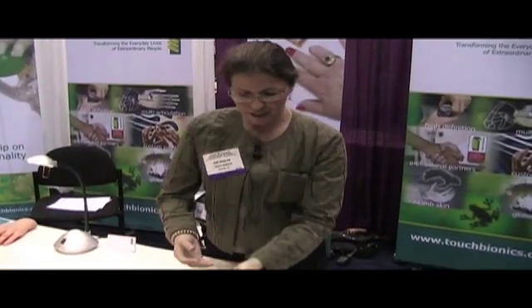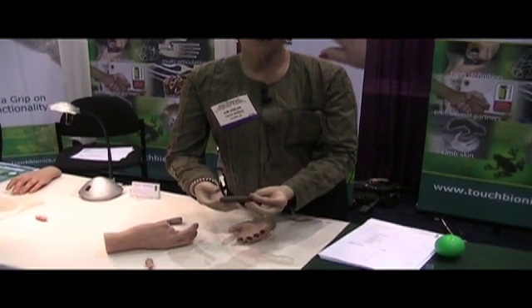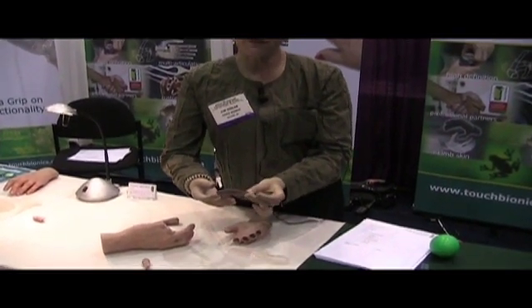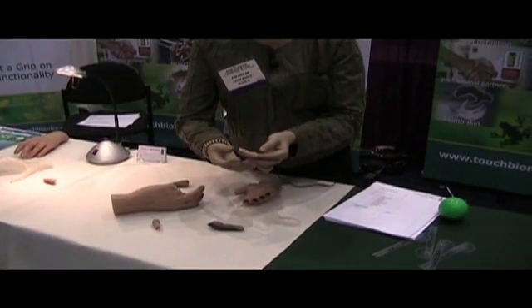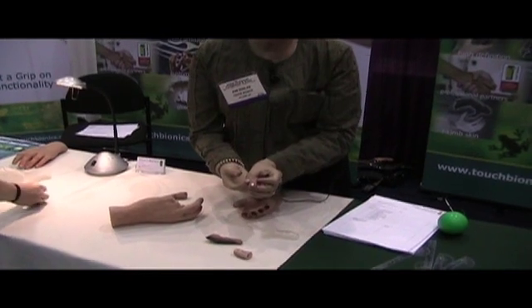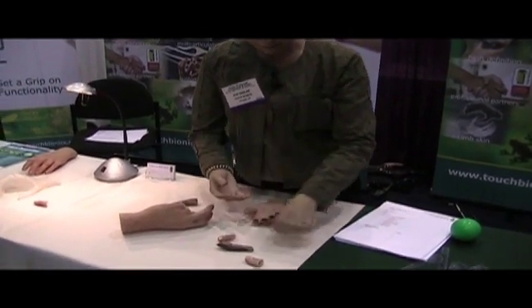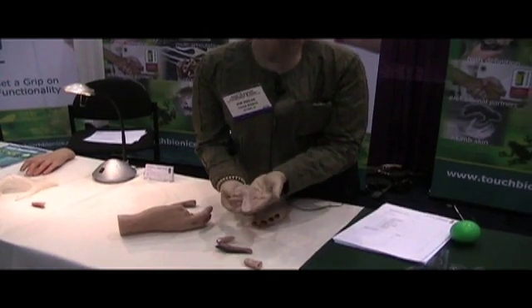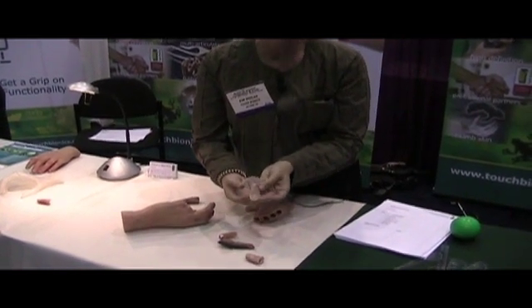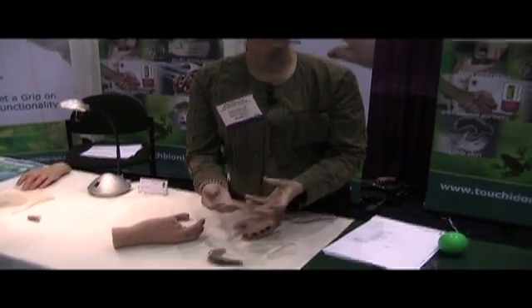Primarily, the patients that we fit with Living Skin prostheses are finger amputees. We can make anything from a full finger to a partial finger like a thumb tip. We also work with lower extremity amputees and can do toes, partial feet, and full feet. Each prosthesis has a clear skin on the outside and the painting is done intrinsically, which gives them a nice depth and translucency like real skin.